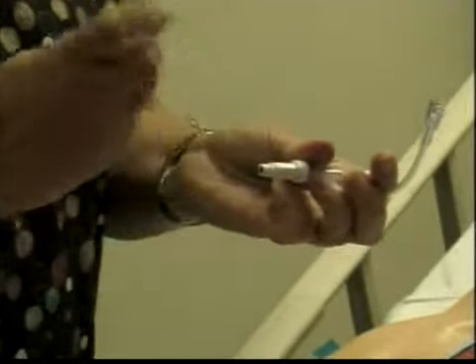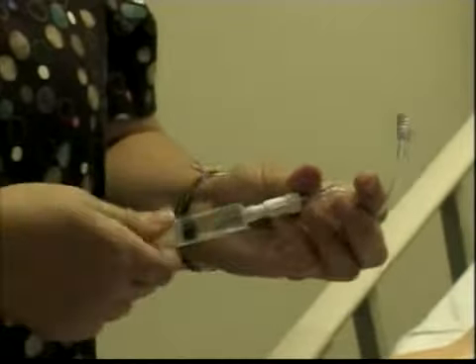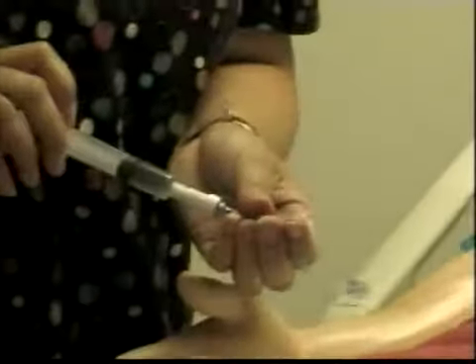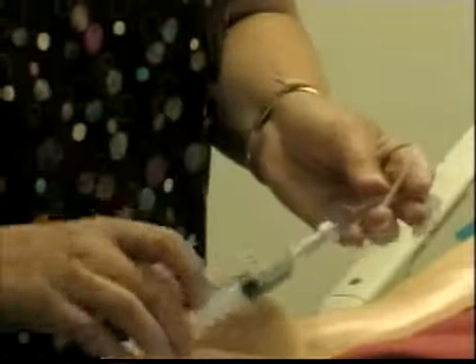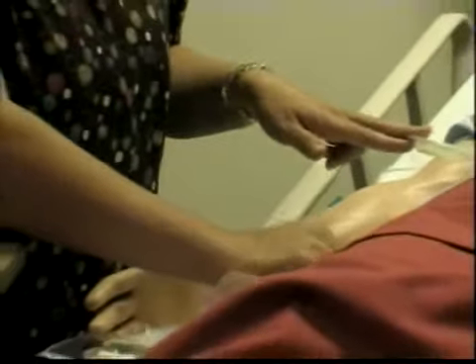I will connect, making sure that I get all the air bubbles out. I will connect, and I will prime, making sure that I get all the bubbles out. And I will put it in such a way that it doesn't get contaminated and is easy to access.